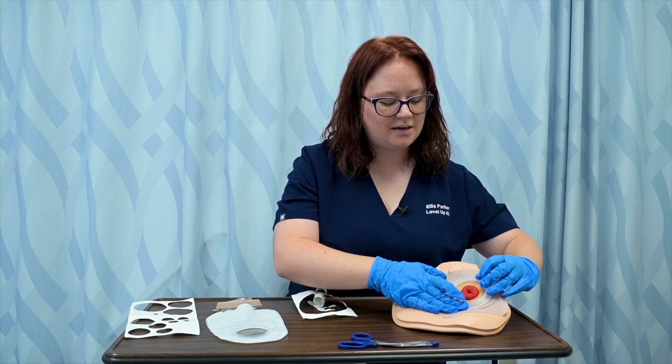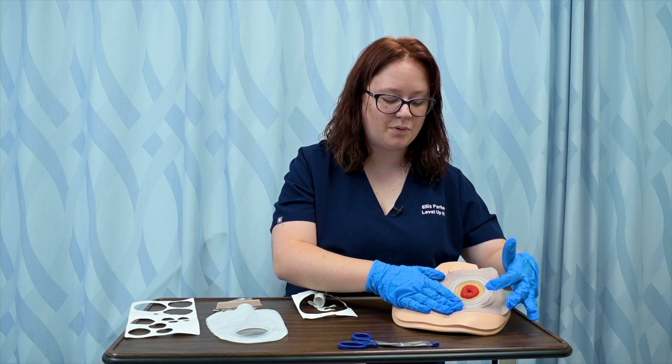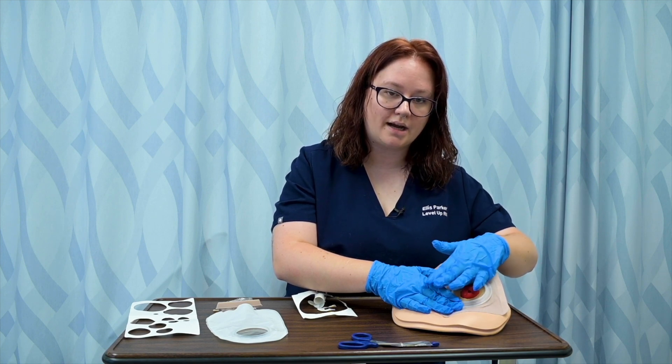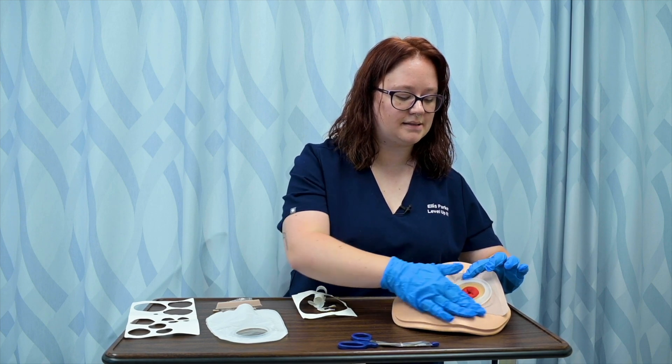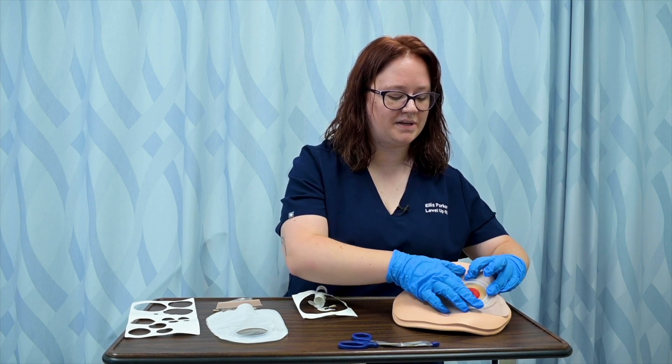Again, so that none of the effluent that's exiting the stoma can get under the wafer and come into contact with the skin itself. I can press it down for a few minutes, making sure it is firmly set in.